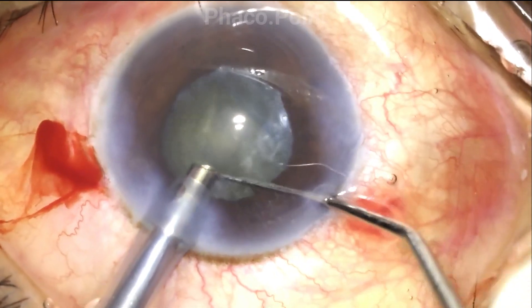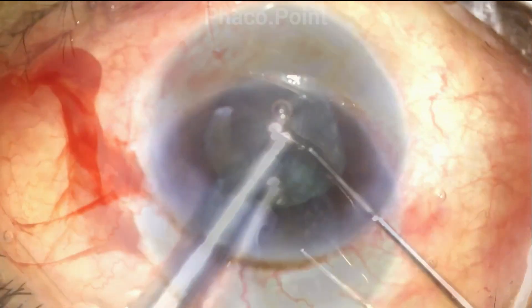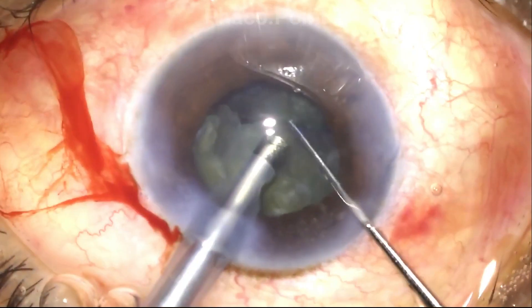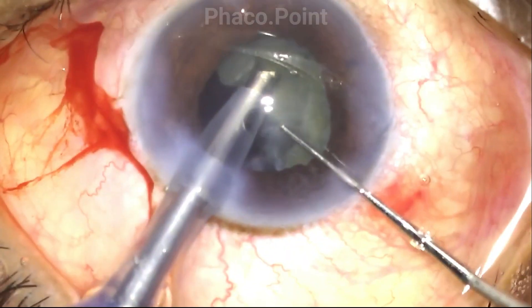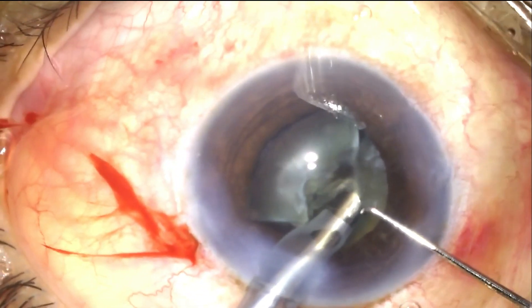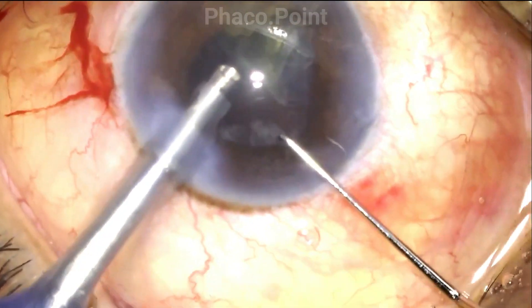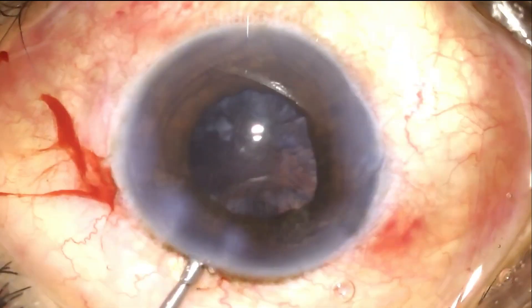We now proceed with the direct chop procedure. The fairly centrally placed inferior rhexis causes a significant challenge to nucleus disassembly. In hindsight, I think it would have been better to enlarge the rhexis prior to nucleus management itself. The nucleus is suitably downsized and emulsified.